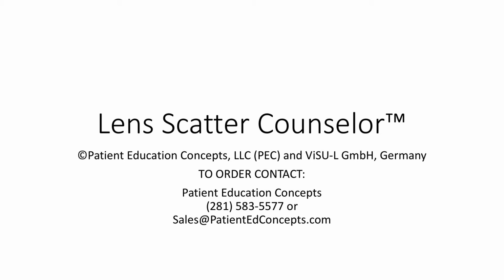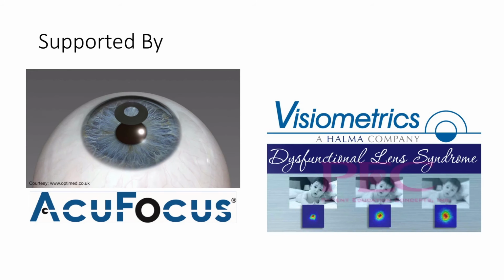This short webinar will give you a brief overview of the Lens Scatter Counselor that is now available from PEC to help you explain how a patient's objective scatter index, or OSI, can affect their vision. The Lens Scatter Counselor was created with the support of AcuFocus Incorporated and Visiometrics Incorporated and intended for practices that use the AcuTarget HD Instrument or the Visiometrics HD Analyzer.